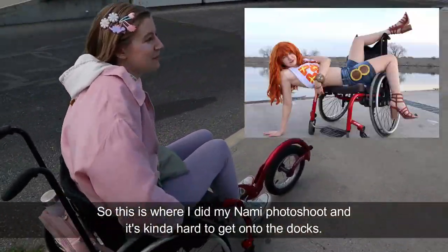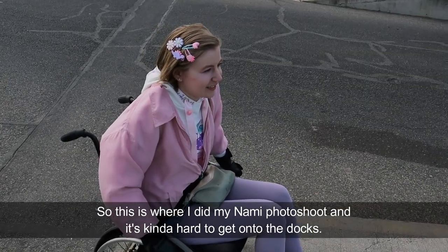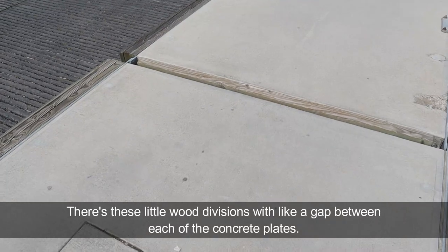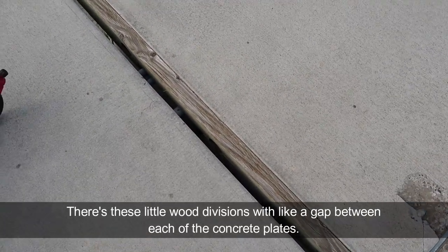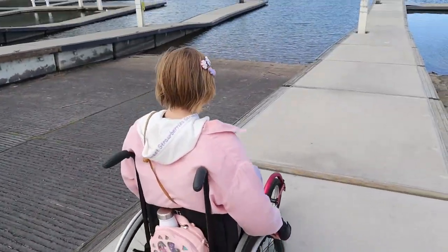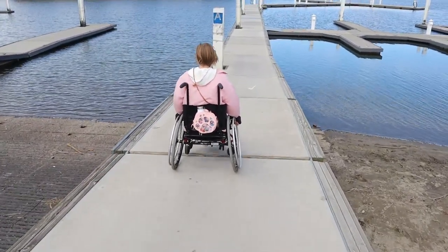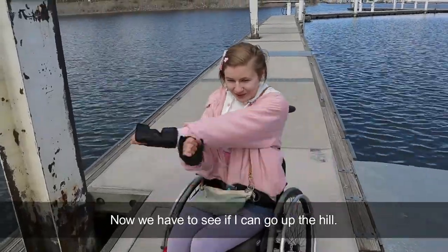So this is where I did my NAMI photo shoot, and it's kind of hard to get onto the docks. There are these little wood divisions with a gap between each of the concrete plates. So I'm going to see if the freewheel can go over without getting stuck. Now we have to see if I can go up the hill.